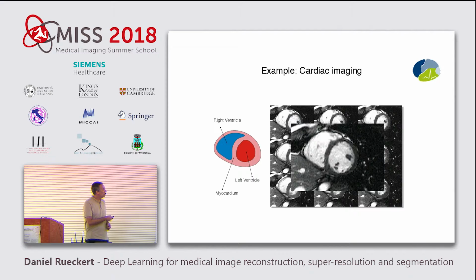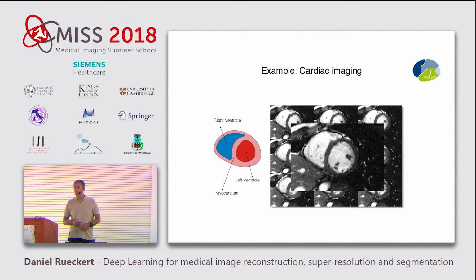The first option is to image as fast as possible and go to real-time imaging. You can actually get to real-time imaging, where real-time really means you can image 2 or 3 frames per second, so it's not quite what we would call normal frame rates. But the problem is you can only acquire 2D data at best, and the image quality is usually much worse than if you acquire conventional imaging.